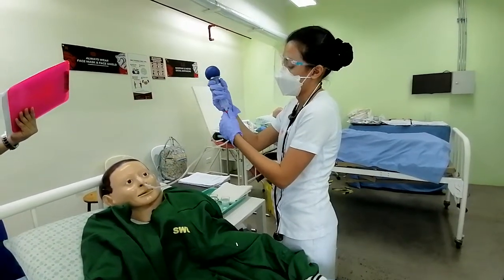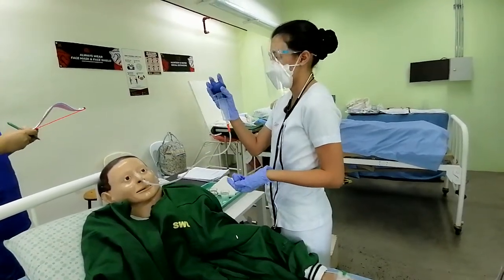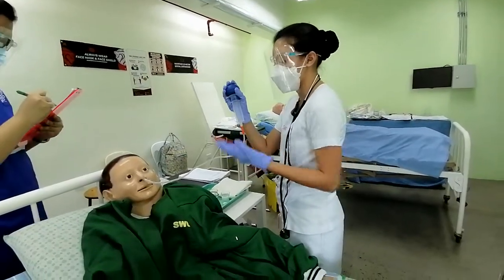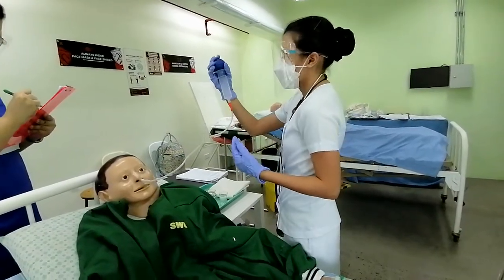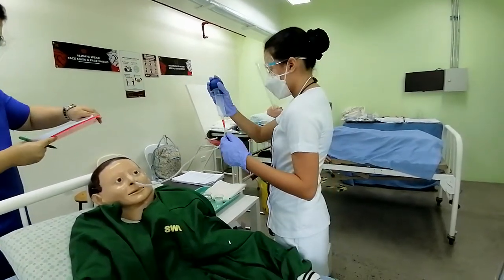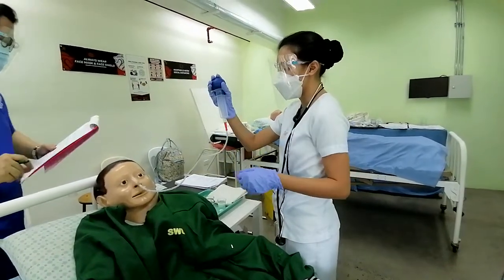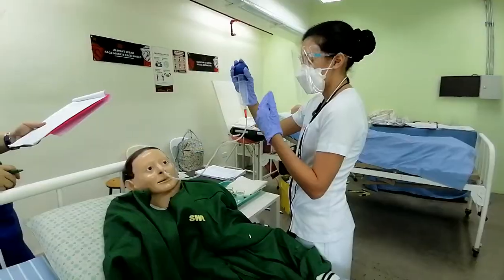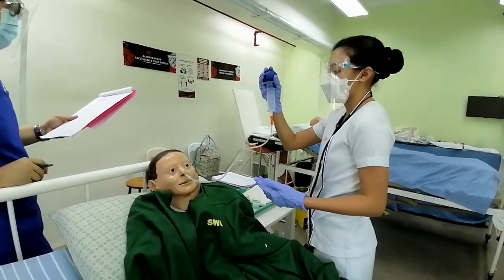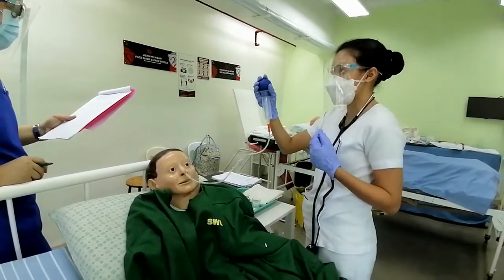And after that, when I introduce air and then I pull back this part, of course the gastric residuals will be aspirated as well. And then I will check if it is beyond one half of the syringe. I will place it in a cup and then report it to the physician and then hold the feeding. But if it's less, then it's okay. I will just put back the gastric contents. It also contains electrolytes. The patient will be at risk for electrolyte imbalance.